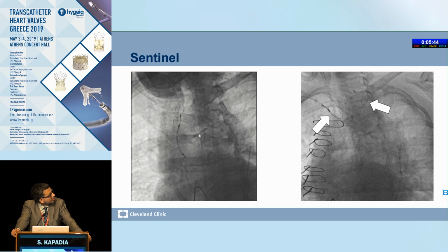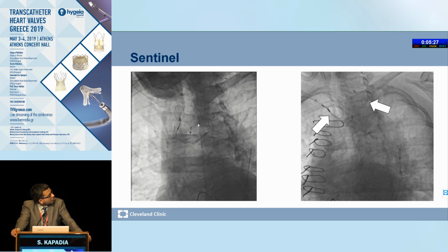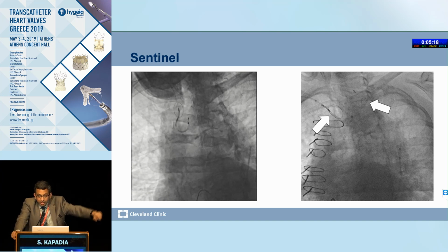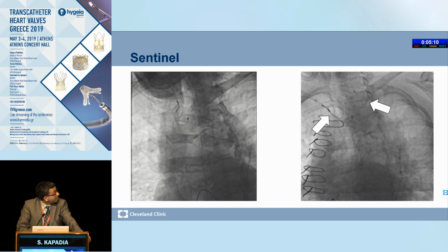This is the reason this patient is good, because there is some calcification on the inner border of the aorta. Slowly flex the device, and then you find where the carotid would be. So the carotid is roughly there. You flex it a little further and put a small wire like that. The wire goes in, and then you pull back and put the device. The device, as you can see, is in the left carotid, and this whole procedure typically takes 2 to 3 minutes. This was 1.5 minutes.